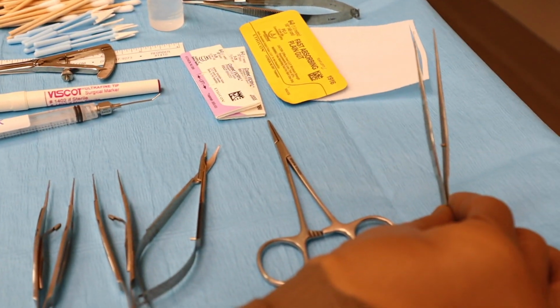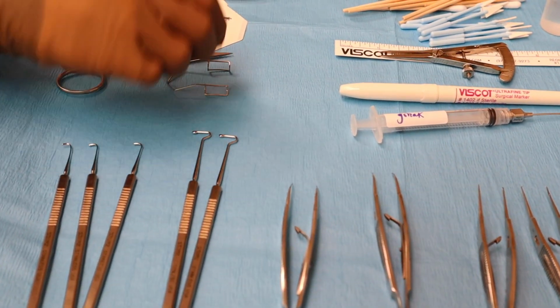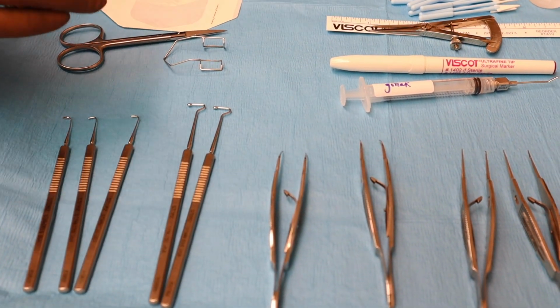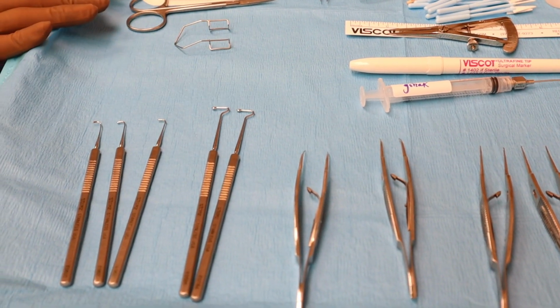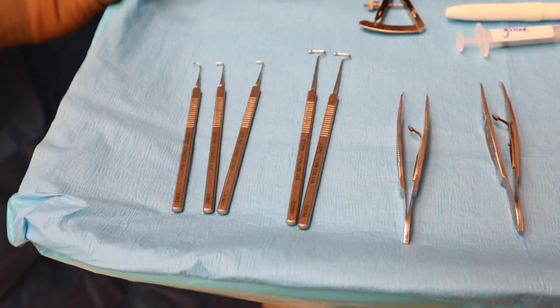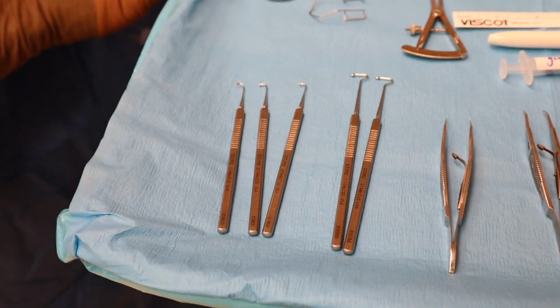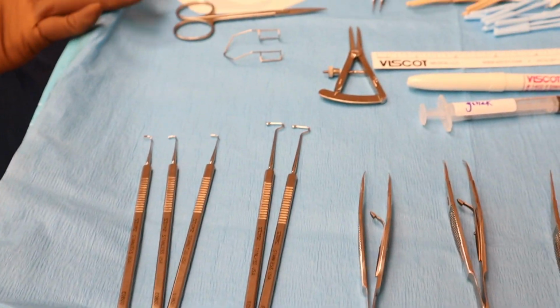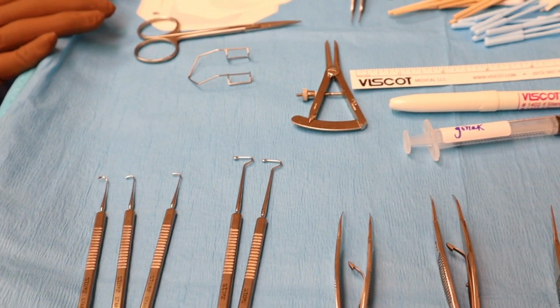So, basically the main thing is you want to make sure that your Mayo stand is set up exactly the way that you want it, so you can easily grab things if you need and if your assistant's not available. Again, I'm very anal about the way that the instruments are pointing and the order in which they're laid out on the table. Because I have someone new assisting me today, she'll know exactly what it is, or I can just get it for myself.